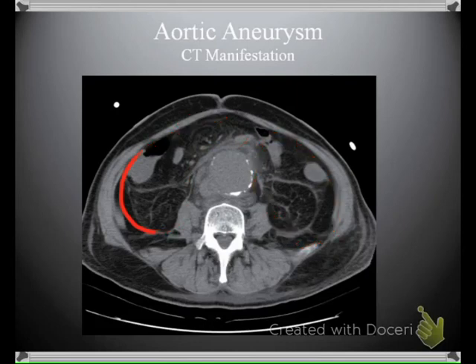We also must understand that something is going very wrong with this aorta, because we do see what looks to be a bulge within the aneurysm here. And if we'll notice, we're at the level of the left iliac crest, and so this would mean that we're getting close, or we should be seeing bifurcation. And so we could potentially say that this is where the bifurcation is going to occur, and one of our iliac arteries has a very large aneurysm. However, it's difficult to discern.